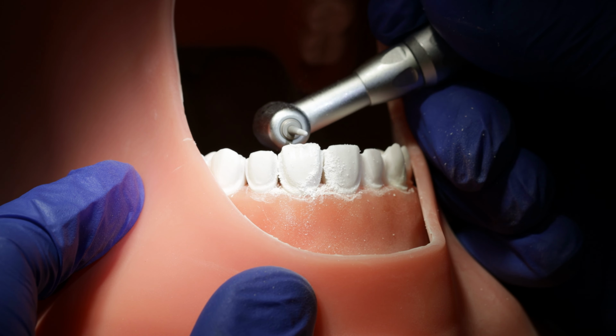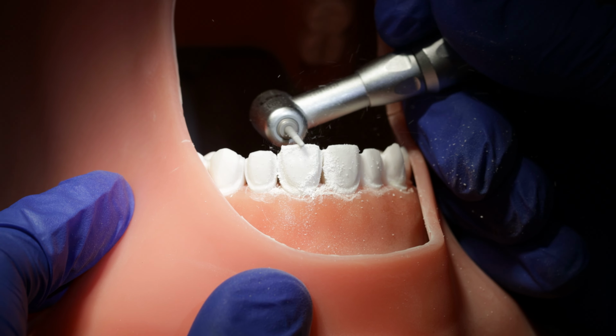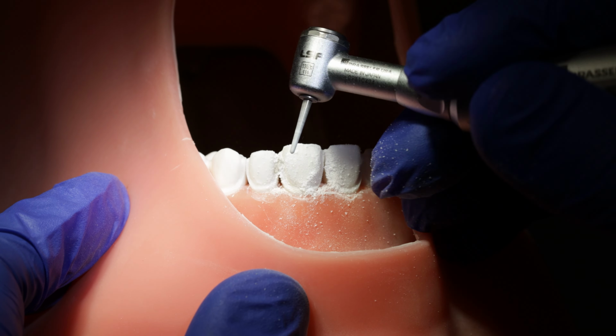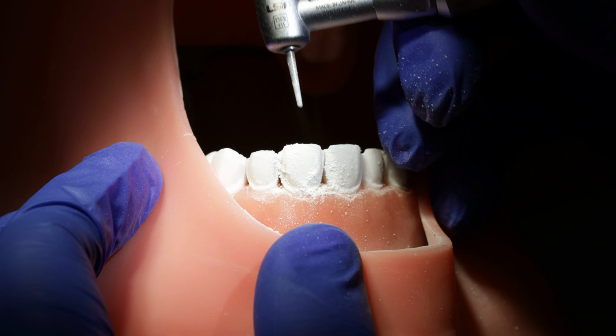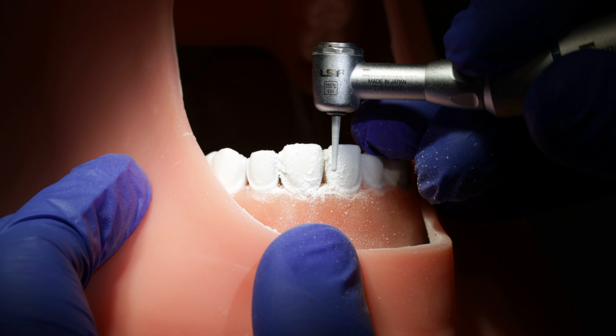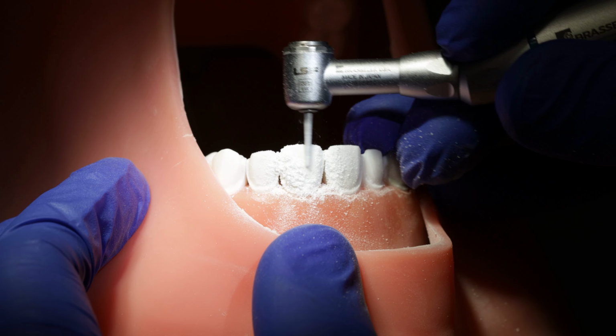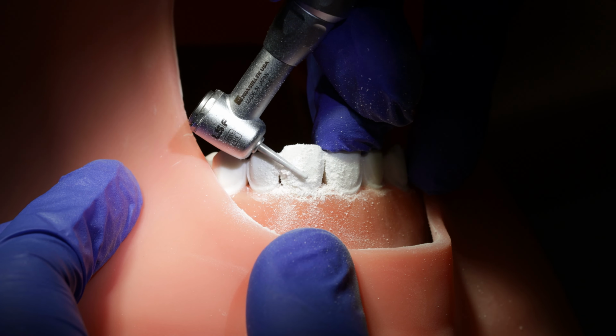And when it's 0.5 millimeter like this, you don't necessarily need a matrix or a big reduction guide. You can just use your probe, and it's not hard to find a 0.5 millimeter reference point. For us, we're just going to use the adjacent teeth because they're already prepared, and we'll just go from there.